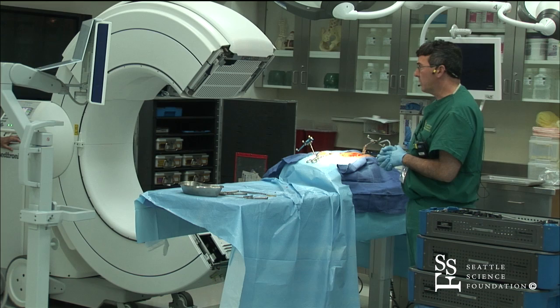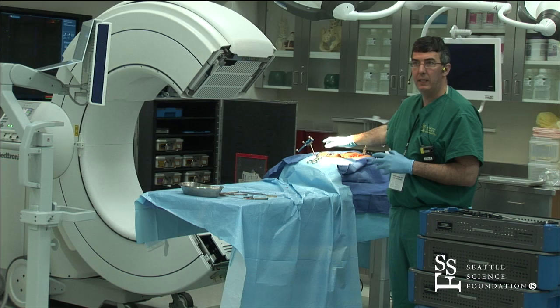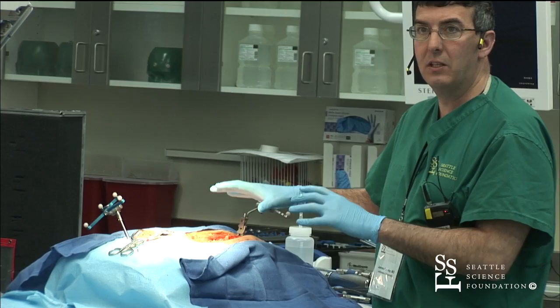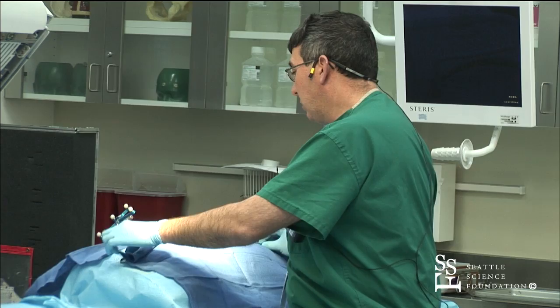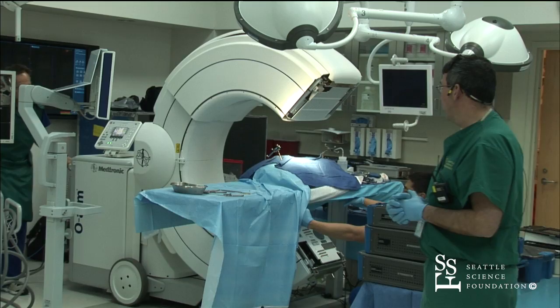So we're just going to quickly show how you get it done. There are a couple of things as to why you have to use it regularly: you have to know where to put your image guidance system, because there's nothing more frustrating than knocking it with your hand and having all your information come off. So what we usually do is we do the whole dissection ahead of time, retractors in or out. Once everything is completely done, we always put all our screws in. You do not manipulate the spine until after you've got all your screws in.